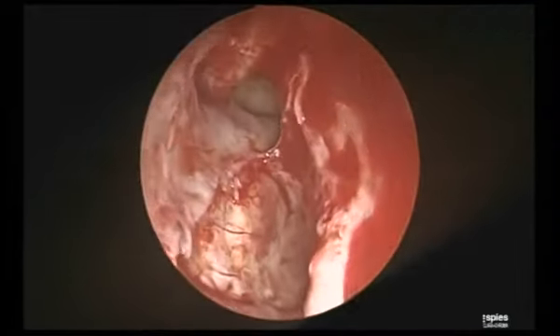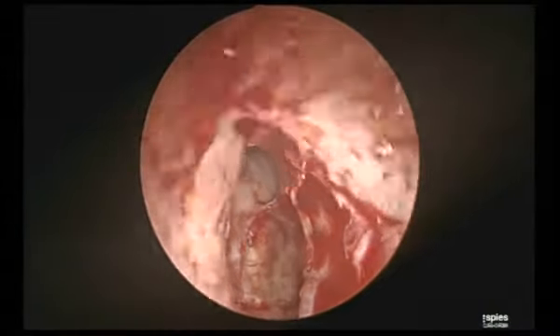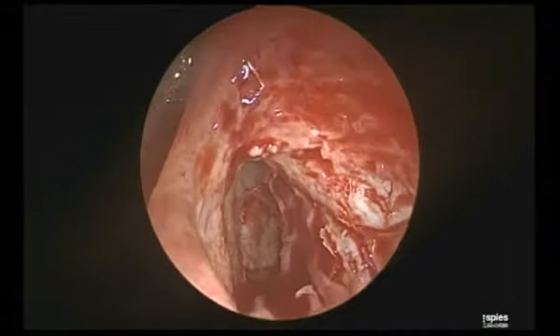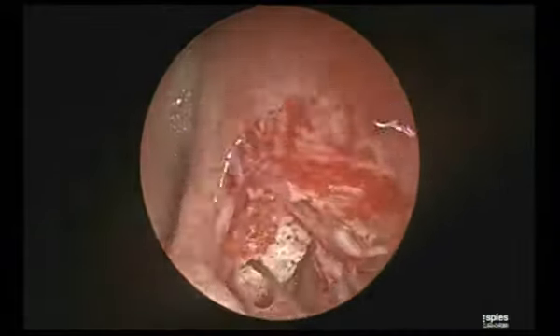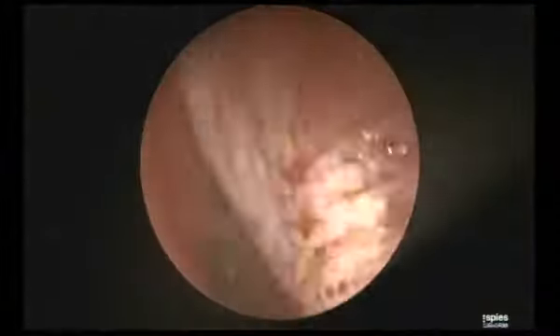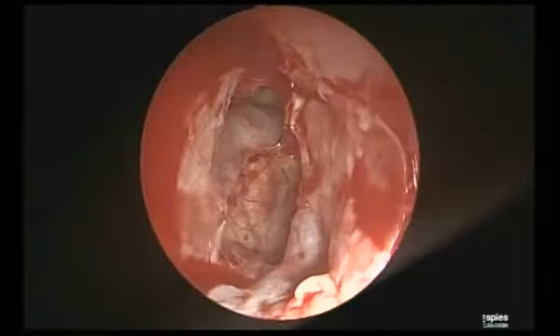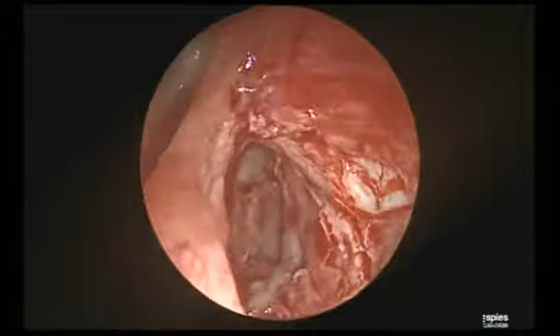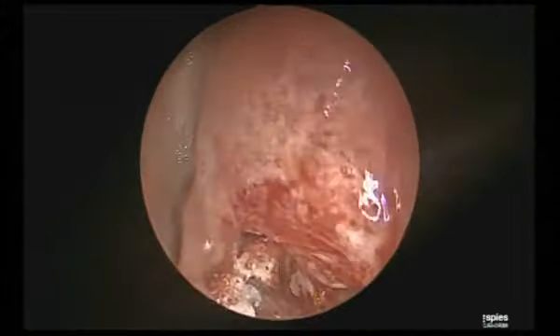To me, there is a simplest answer to the limits. If you are working in the frontal to its maximum anatomical limits, yes. It's not a question of 3 millimeter, 7 millimeter. I have seen the reports, people telling if the final frontal sinus ostium size is 9 millimeter, it is unlikely to stenose. It doesn't work like that. So the size you are measuring is just monkey business, I tell you.